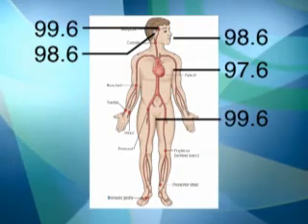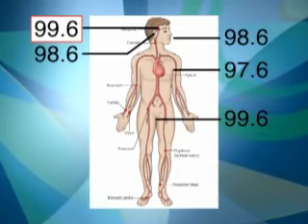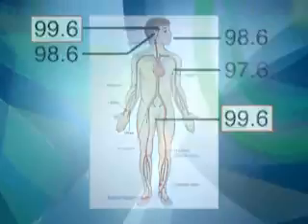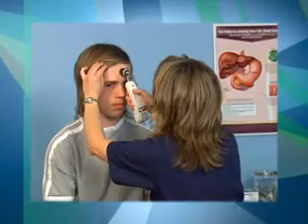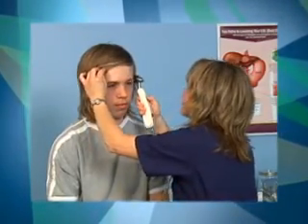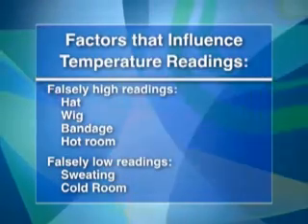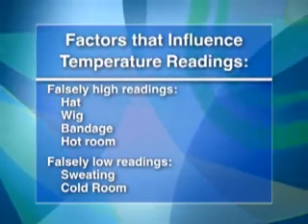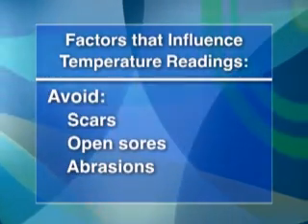Temperature readings vary according to where you take them on the body. The temporal artery reading is about the same as the rectal site. The forehead needs to be fully exposed to the environment to obtain an accurate reading with a temporal artery thermometer. Before taking the patient's temperature, check for any factors that might influence the temperature reading and correct them. If they cannot be corrected, choose another method to take the patient's temperature.